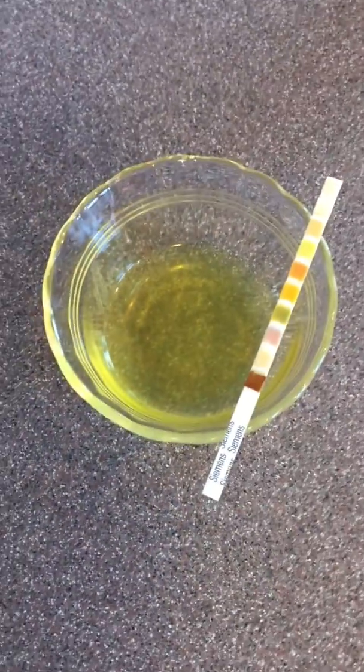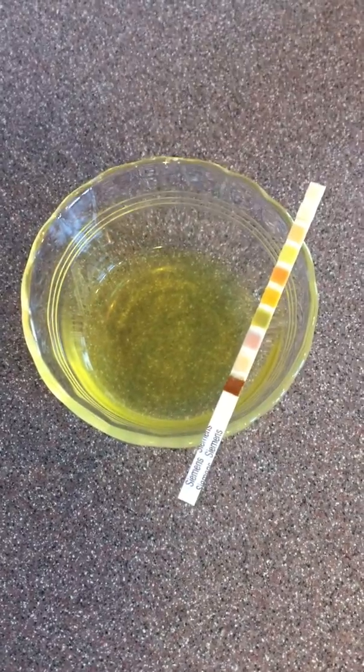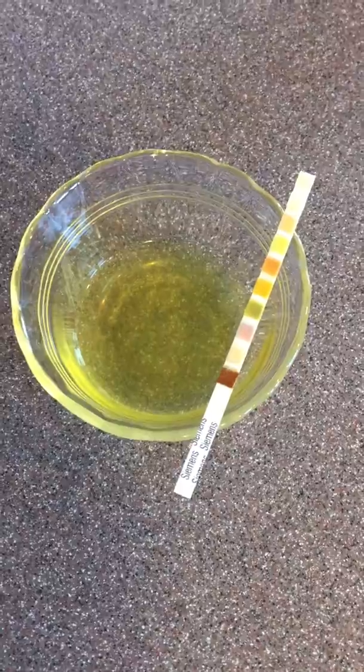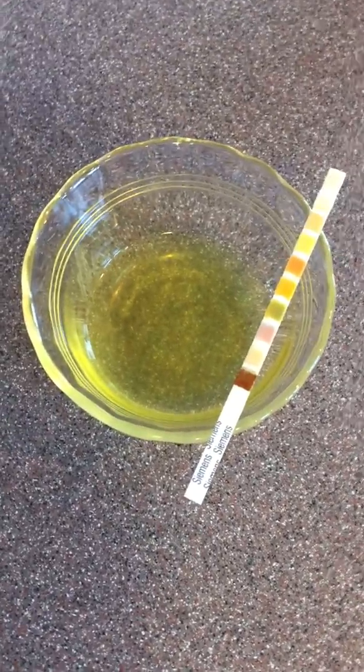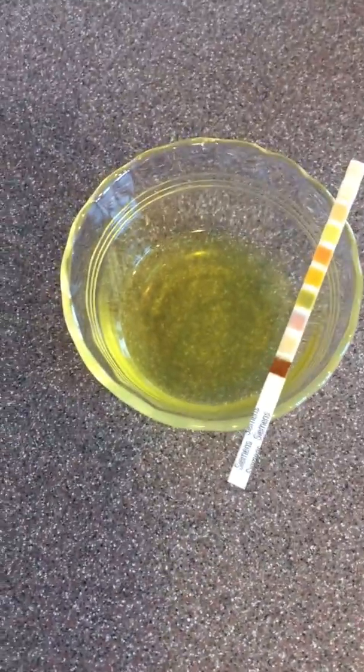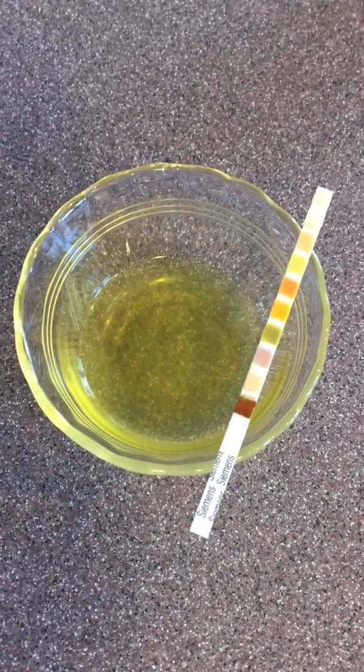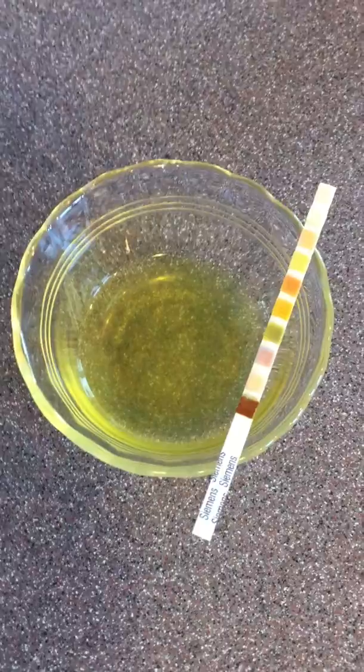So there's today's urine lesson for all of you that have diabetics, or for those of you that may be asked to test on an ongoing basis. And again, if you have a diabetic dog, we do not test this every day because we know we're going to find glucose in the urine because we have a diabetic and ketones. You may test once a week.